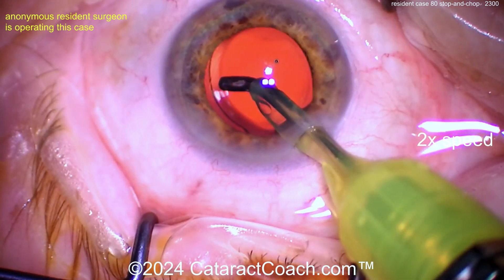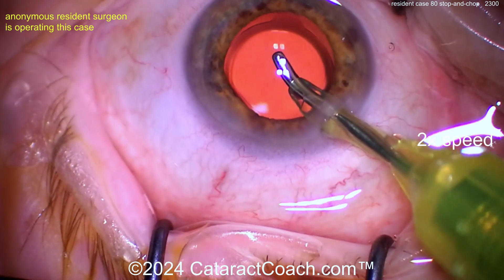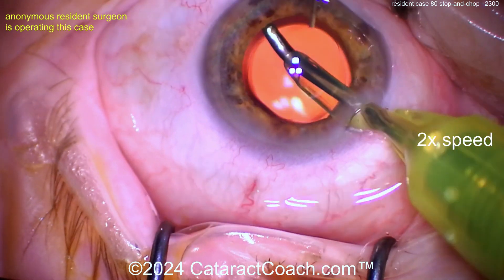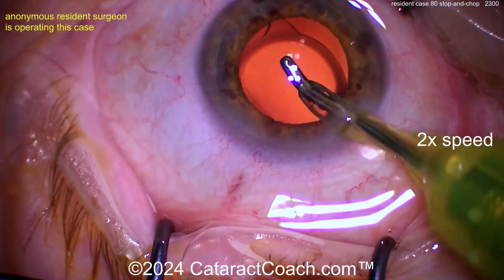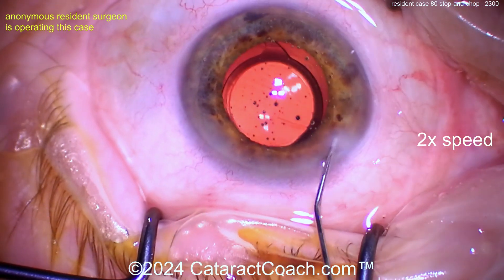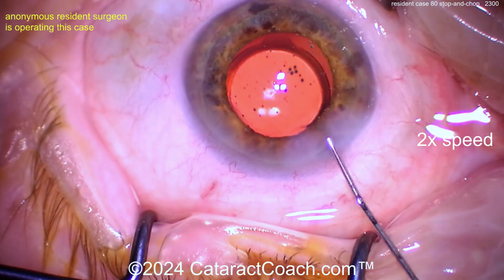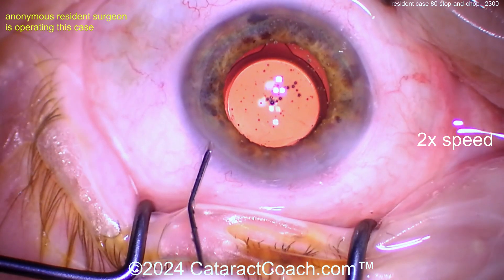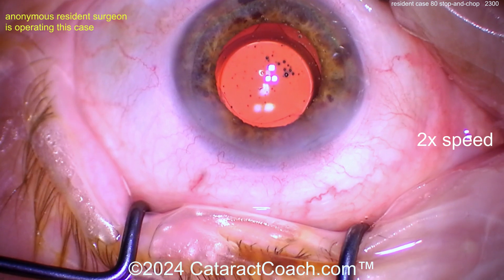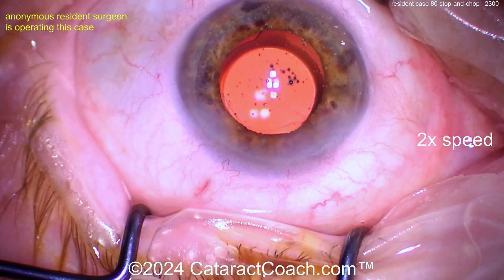Young surgeon, you are doing a fantastic job. Case 80 is impressive — you'll be world-class in the not-too-distant future. For the review: I still didn't love your incision, but your rhexis is pretty good for case 80, the groove was fantastic, and the stop-and-chop technique was very good. I'm not a fan of hydrating the sides but maybe your attending is — and that's okay. Just a little bit of the eye going out of primary during phaco, but overall a great technique.